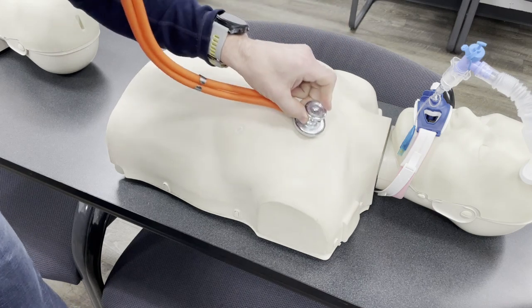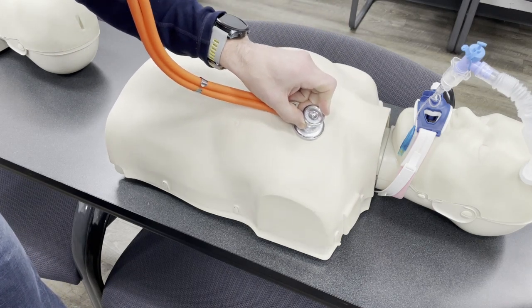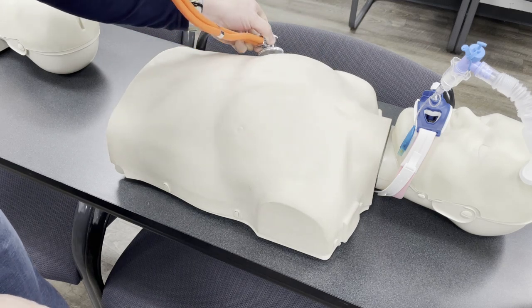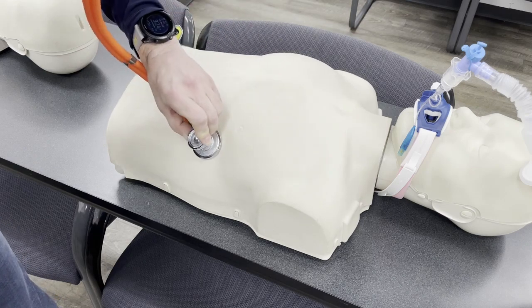Please watch the rest of the videos in this folder for expanded instructions on ambulance ventilator transport. This is only a crash course review and is not intended to stand alone.